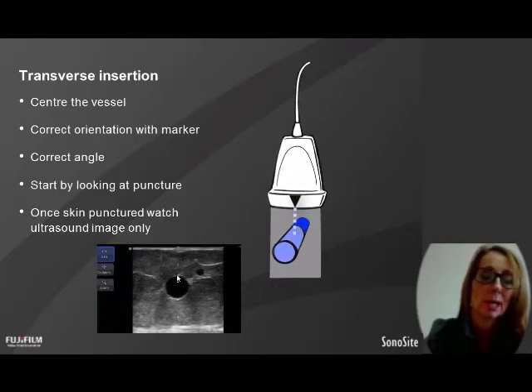You'll usually know you're about to puncture because the vessel starts to tent in, starts to bow in, and then it pops through. As you're threading along, you can make sure you level out and don't continue through the back or the side walls, and you can watch yourself moving down the absolute centre of the vessel until your needle's in as far as you want it to go.